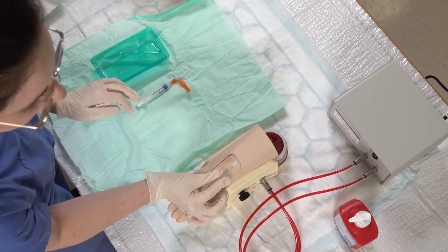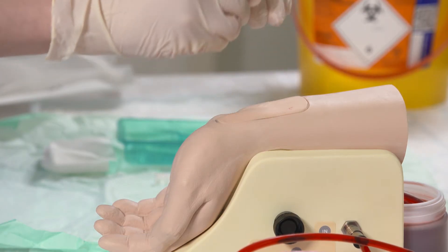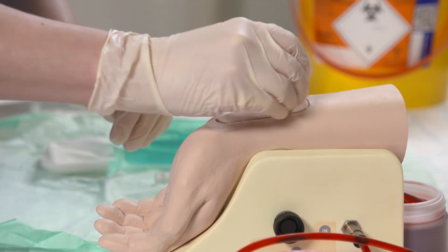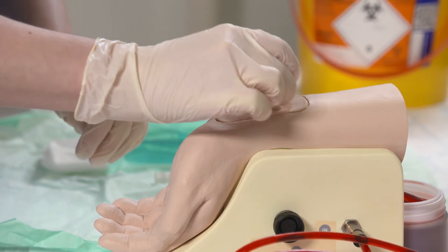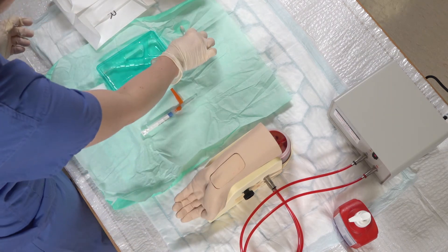I've got some chloroprep disinfectant for the patient's skin, which I'll apply now. And then leave that to dry.